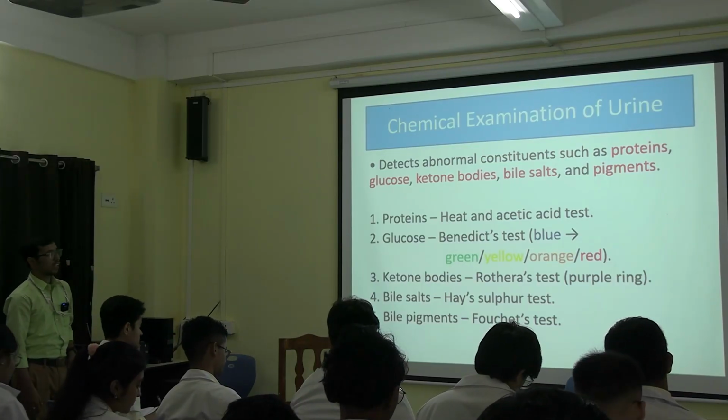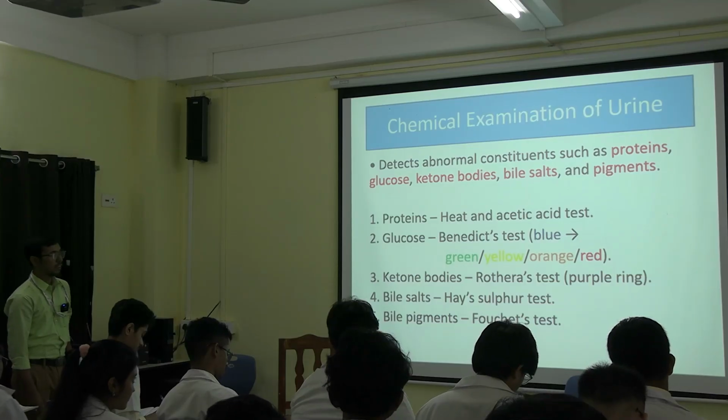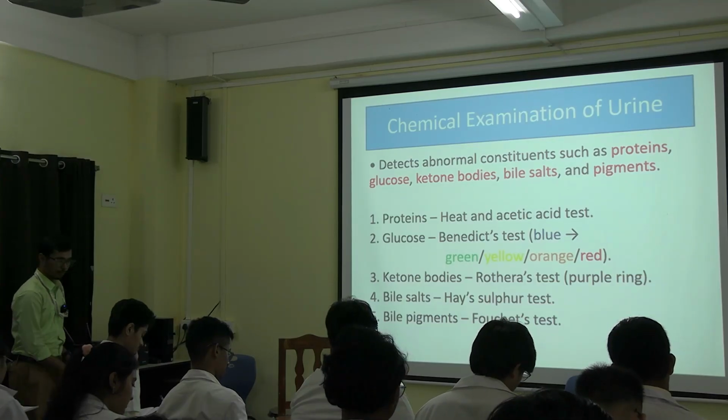Then there is Hay's sulfur test for bile salts. And then for bile pigments, we have Fouchet's test.